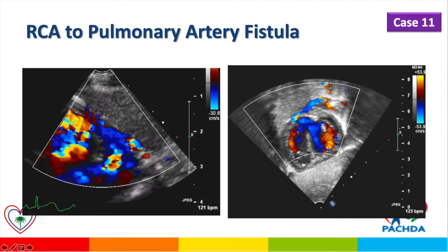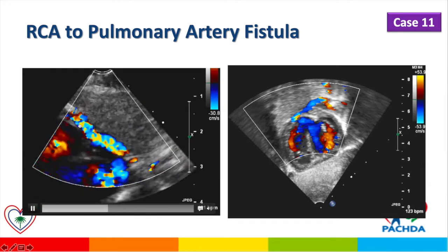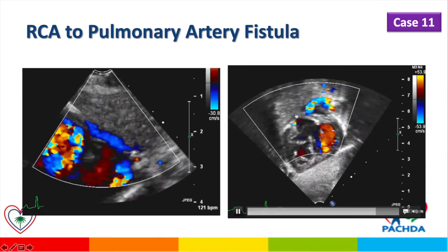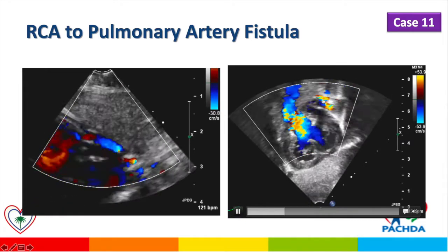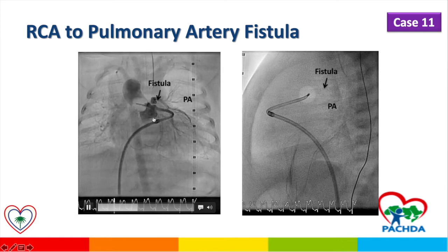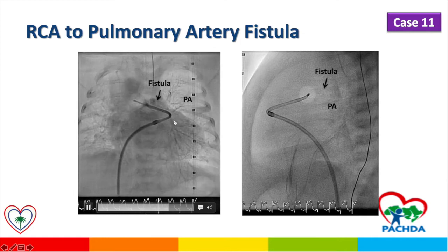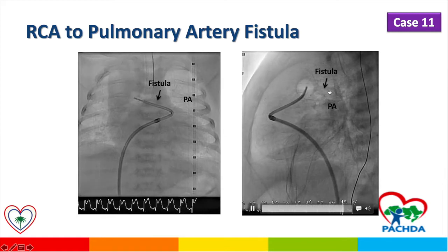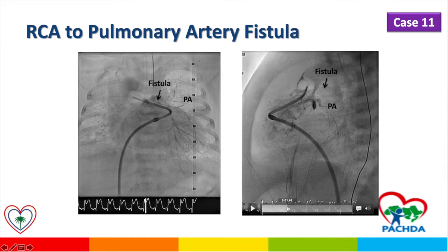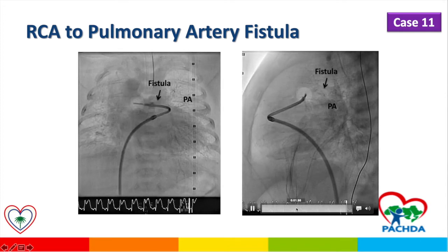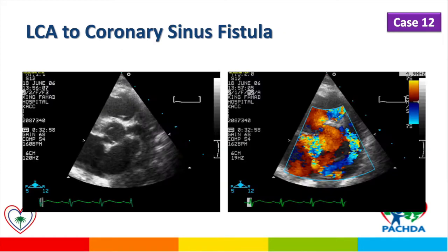This is another patient with a fistula from the right coronary artery to the pulmonary artery. The same patient had an angiogram showing a fistula toward the pulmonary artery, which becomes opacified by injection in the aortic root. The lateral view confirms the right coronary artery and the fistula coursing toward the pulmonary artery. This demonstrates how coronary angiography delineates the abnormalities.